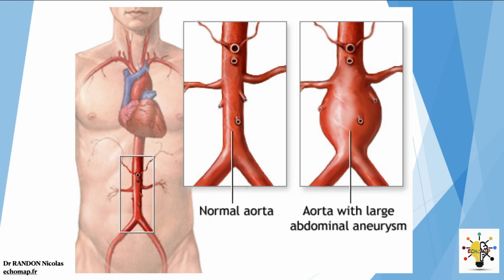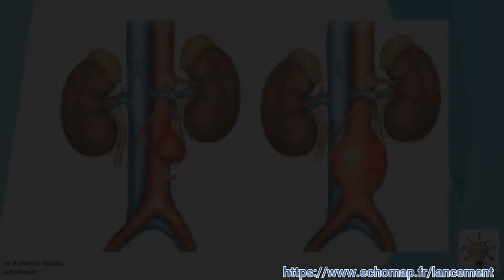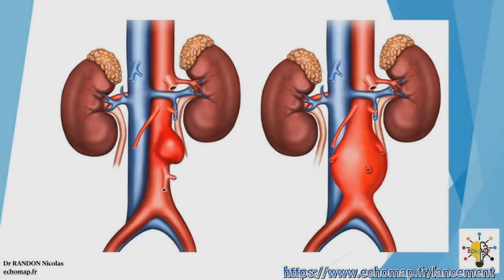What is an aneurysm? It's a modification of the wall. It's a loss of parallelism of the artery walls. As much as at the level of the aorta, there are very strict criteria that have been described, in the periphery, it's a tiny bit more floating. This is based on a diameter that becomes 1.5 times greater than the expected normal diameter. When talking about aneurysms, I'm thinking here particularly of popliteal arteries. So when it comes to the aorta, as we've said, there's going to be a lot of it. Aneurysms come in all shapes, sizes, and locations. Another type of aneurysm, more on that later.